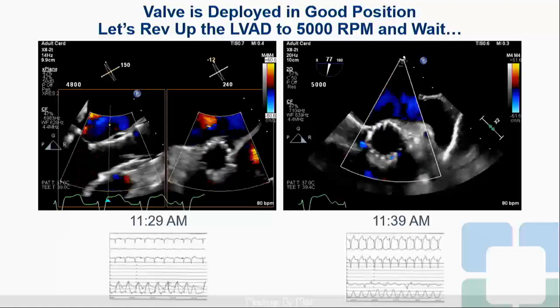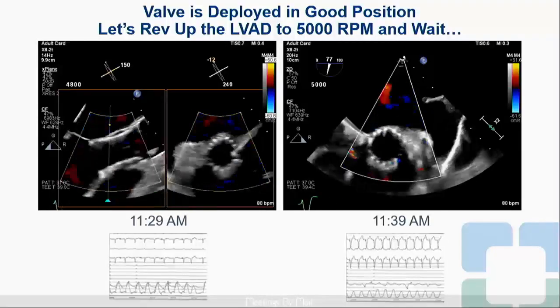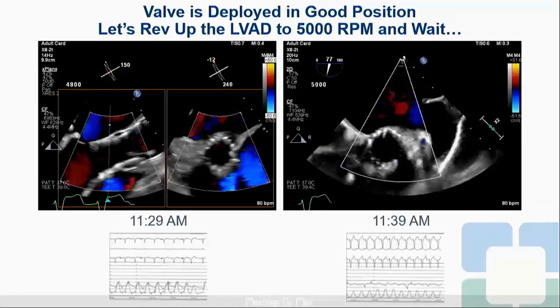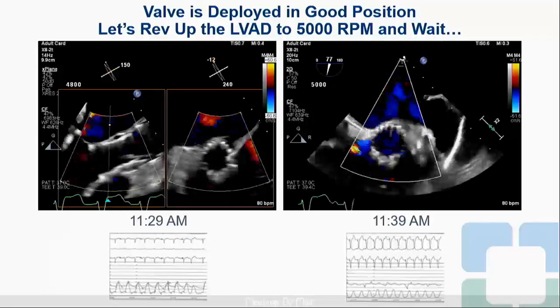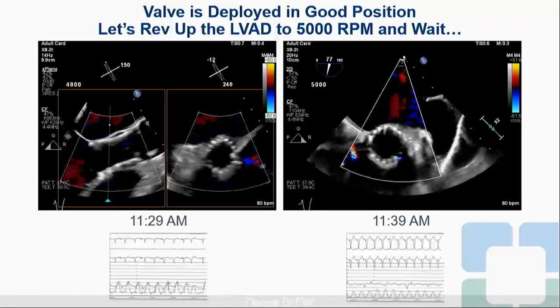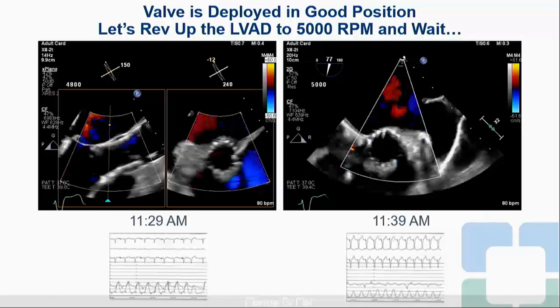A Sapien valve. And what would you recommend? Jenny was doing the TEE, so I'm not asking her, but you are the structural imager, Rhonda. So what would you tell if Samir was in this case? At this point, I think, say your question one more time. So what would you tell if, 10 minutes after you release the valve, you see that little AI?